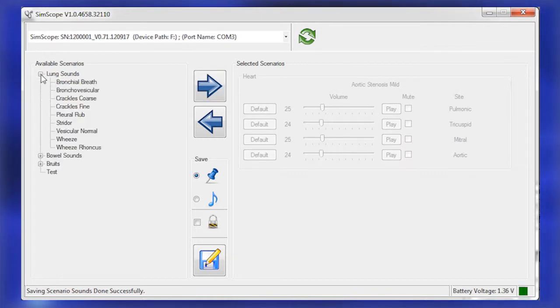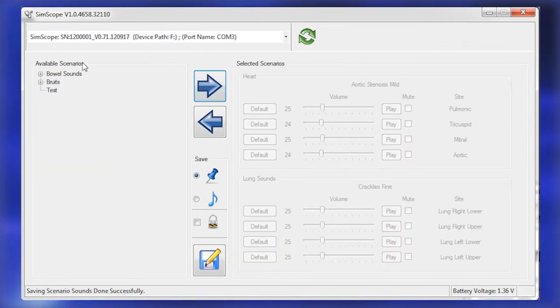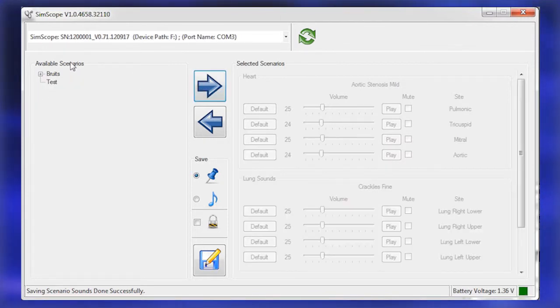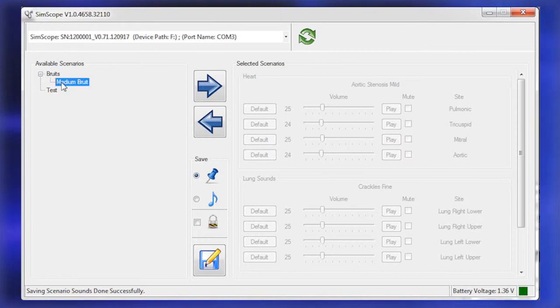Click to highlight a desired sound group within the expanded list. Click the right pointing arrow icon to move the sound group back to the Selected Scenarios box.